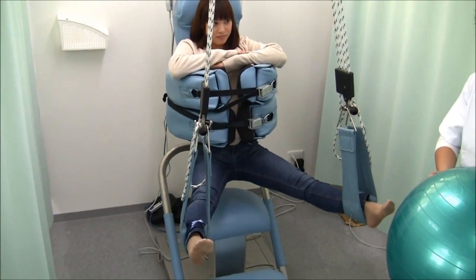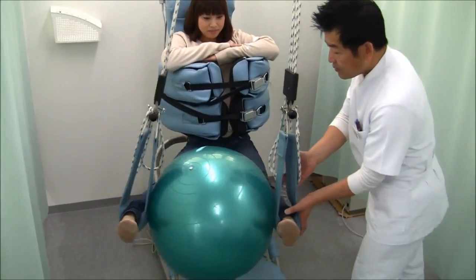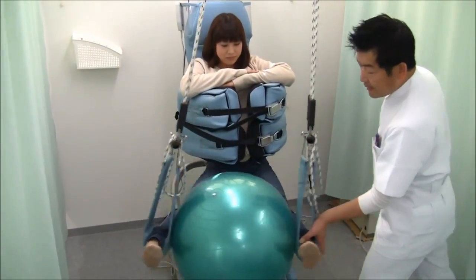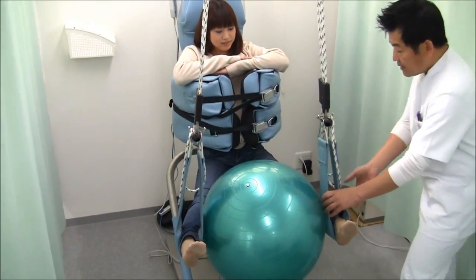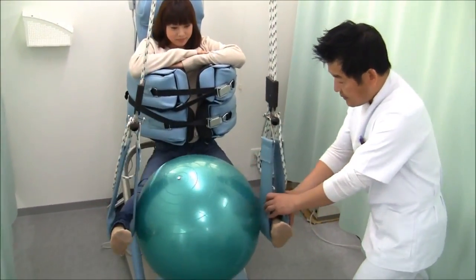Chapter 10. Stretching using a therapy ball. Have the patient place and hold the ball between their legs. Then, swing to both sides. Help show the patient how to perform this exercise and allow the patient to do it themselves. After at least 3 times on each side, have the PT or DC apply resistance 3 more times.